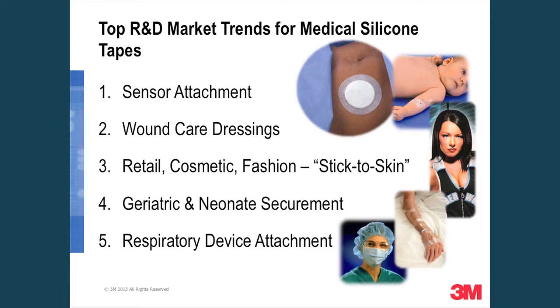Again, silicone adhesives seem to be the way that a lot of the advanced wound care applications are going. Because silicone's inert, it's gentle, it's not going to traumatize the skin around that wound, and with the high oxygen and moisture vapor transmission, it helps keep the skin very healthy underneath. So it's all a real plus for the wound care healing.